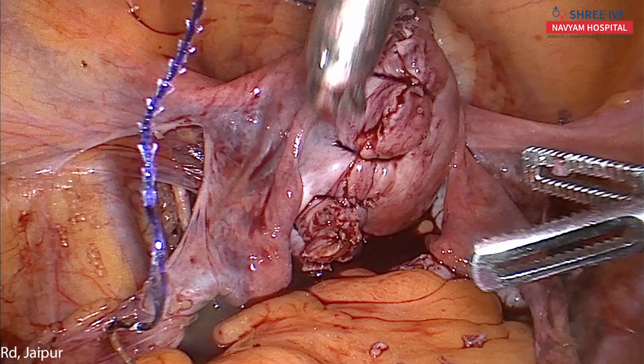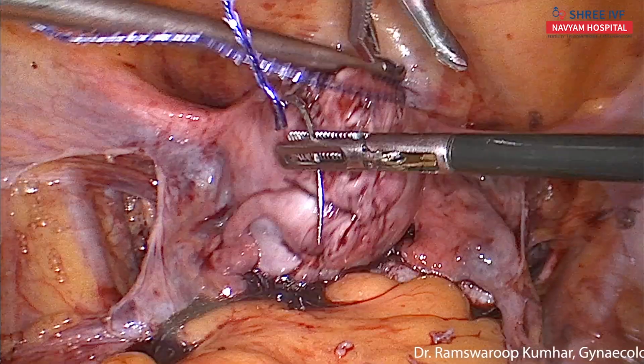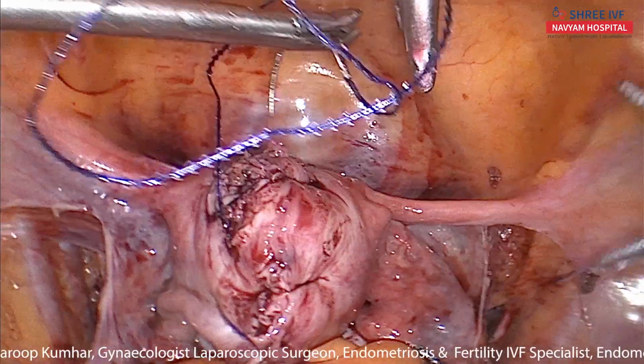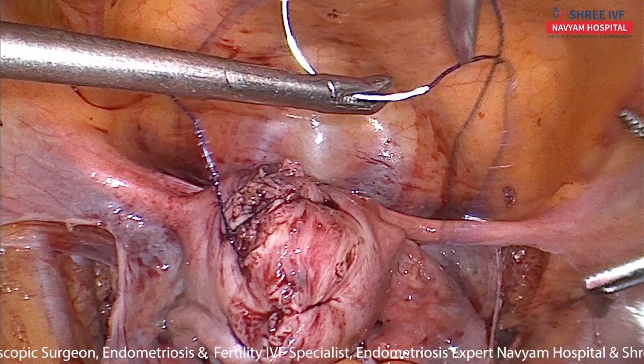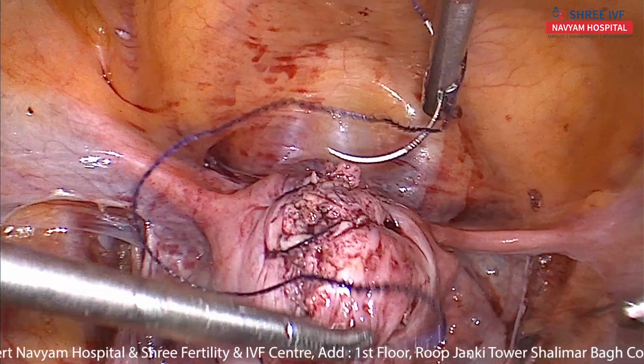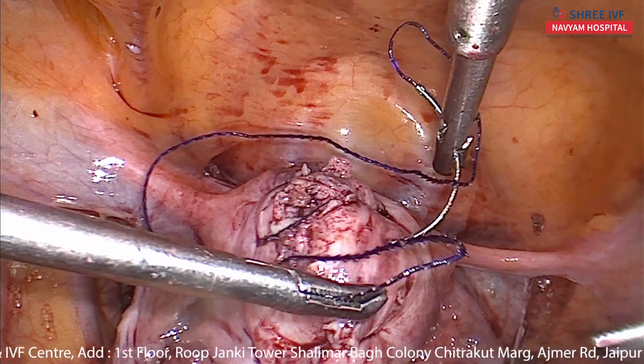I'm not satisfied with the suturing, but what can we do? Okay, what should be done? Second layer. Okay, the suture will be exposed more. One more suture we have to take at this level.